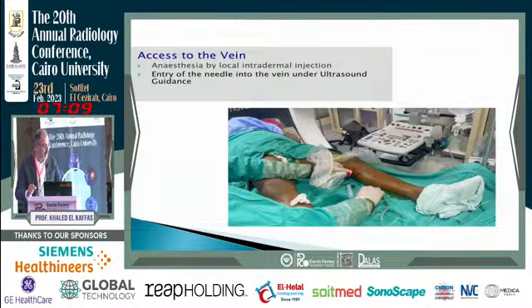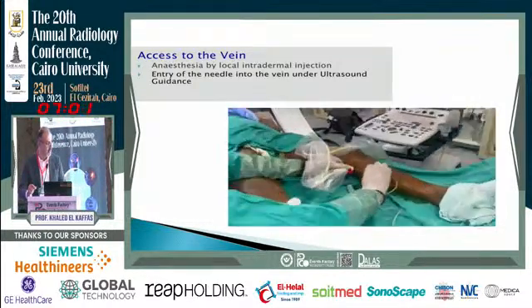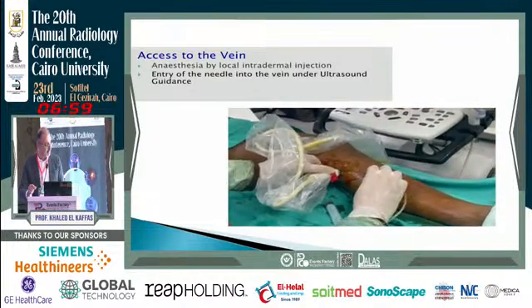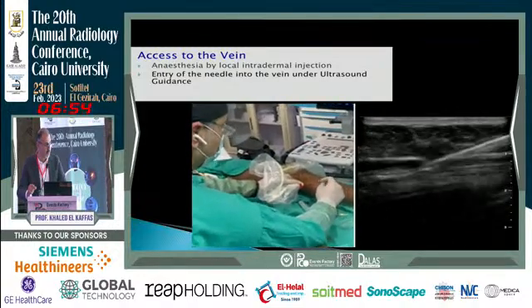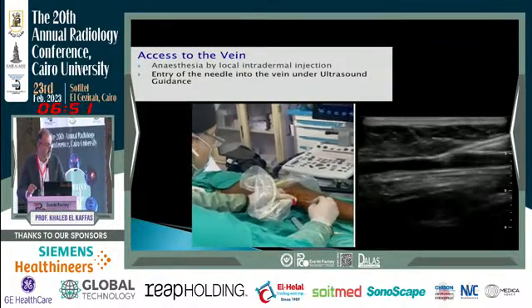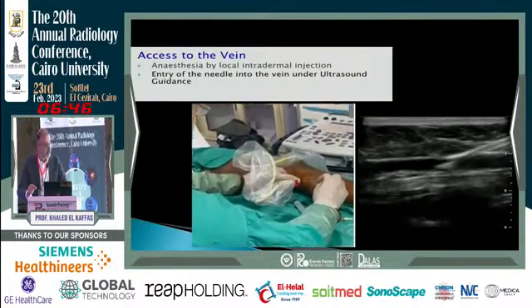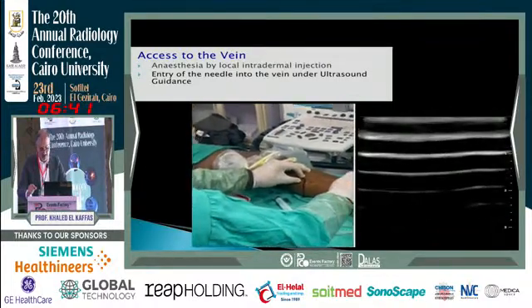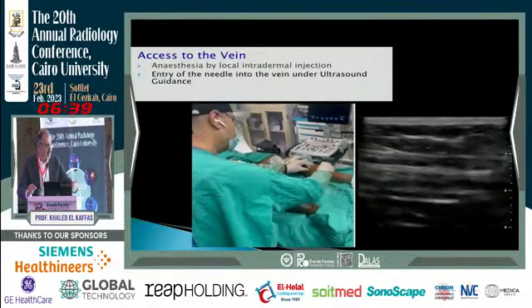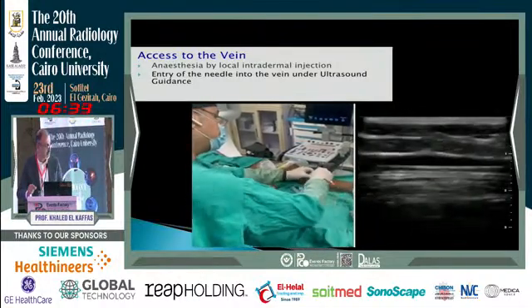Short video. Before we start, it's a local anesthetic procedure. We inject a small bleb of local anesthesia at the site of vein access. Then we start ultrasound guidance. Here we use ultrasound to guide the needle to puncture the saphenous vein. When we're sure we have blood backflow from the needle, we start inserting the guiding wire. Here we are in. When we are sure we are inside the vein by ultrasound, we remove the needle and insert the introducing sheath.